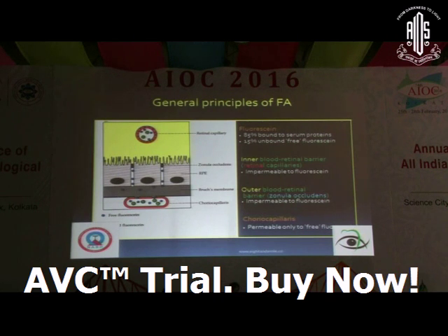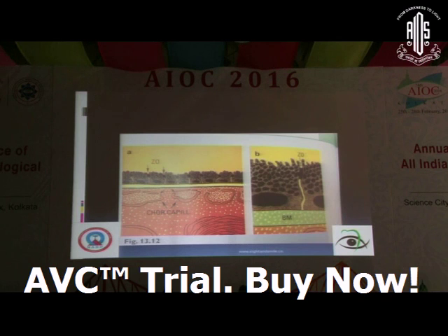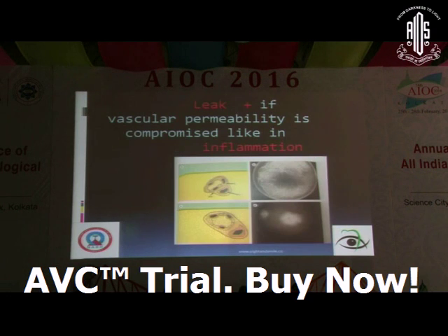General principles of FFA: fluorescein is 85% bound to serum proteins, and 15% is unbound free fluorescein. We have two barriers. The inner blood retinal barrier, the retinal capillaries, is impermeable to fluorescein. The outer blood retinal barrier, the zonula occludens, is impermeable to fluorescein again, and the choriocapillaris is permeable to free fluorescein. There's a picture showing the fluorescein leak and the zonula occludens in the RPE, leaking if vascular permeability is compromised, like in inflammation.